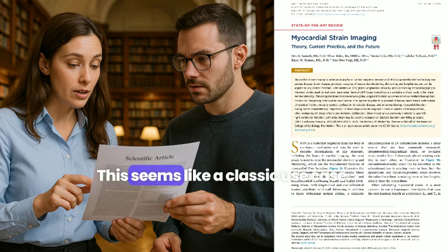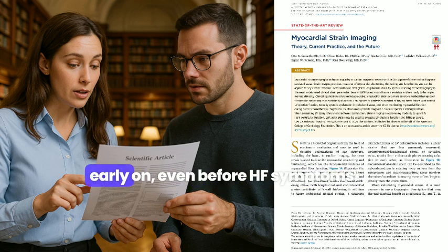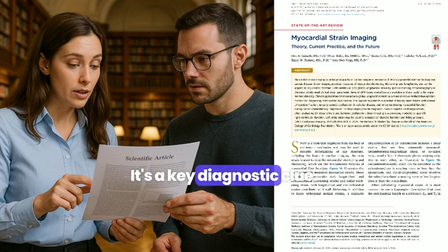Cardiac amyloidosis. This seems like a classic use case. Absolutely. You often see impaired basal strain early on, even before HF symptoms. This creates that classic base to apex gradient, the apical sparing pattern on the bullseye plot. It's a key diagnostic clue.